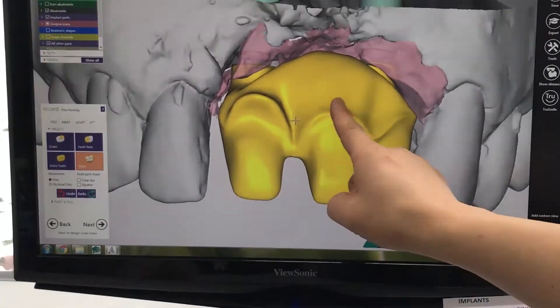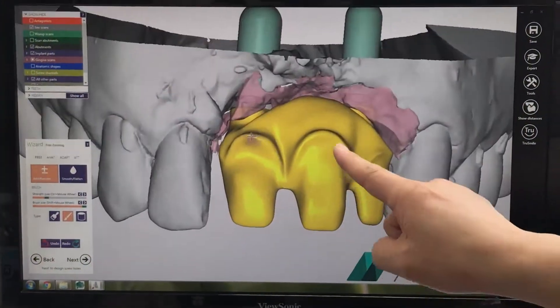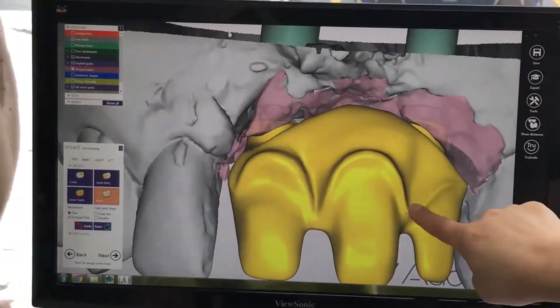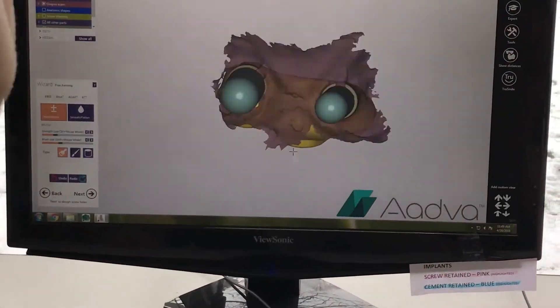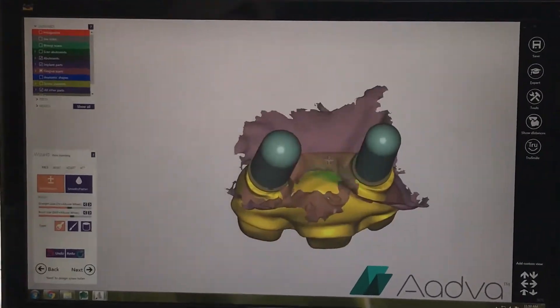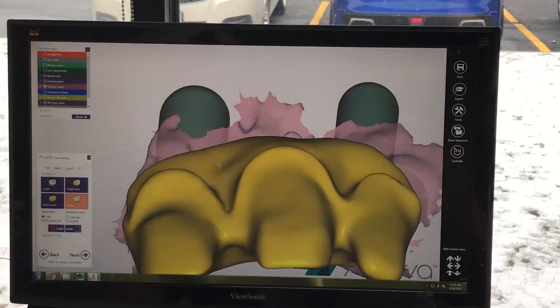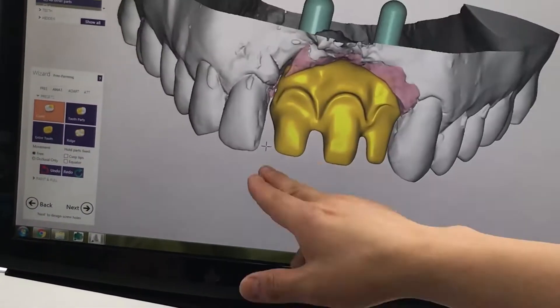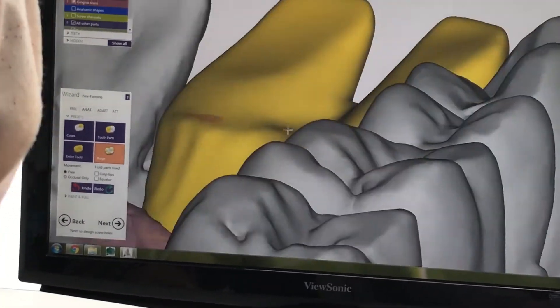And we duplicate the symmetry for the other central. Then we raise the tissue area so that it will touch the gum. Later, we will polish the titanium bar. And we continue to fill in the gaps for the tissue. Then we create deep shoulders for the linguals.